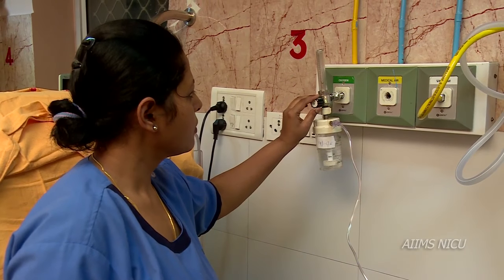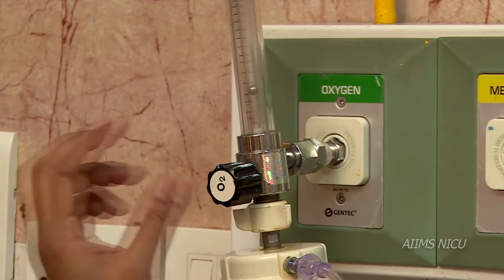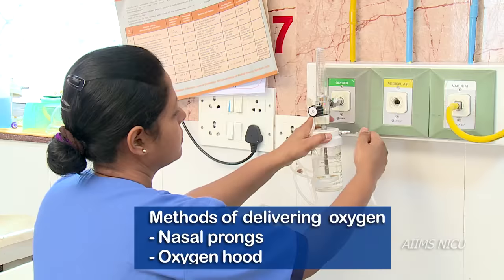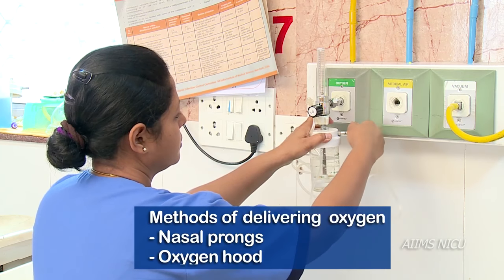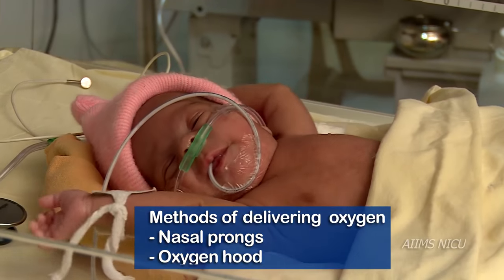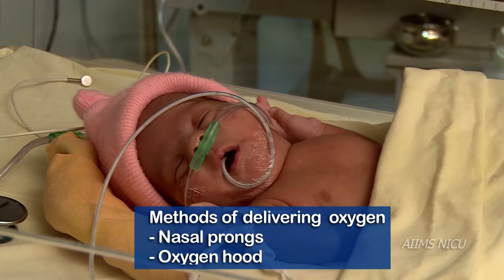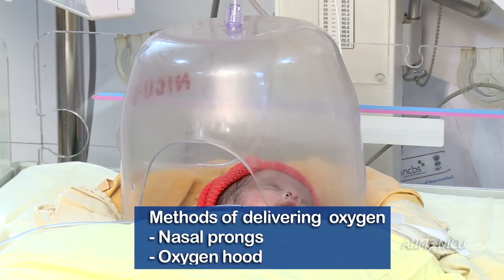In this video, we shall learn the various ways to administer oxygen to a newborn baby. There are primarily two ways by which oxygen can be administered to a newborn: nasal cannula or nasal prongs, and oxygen hood.